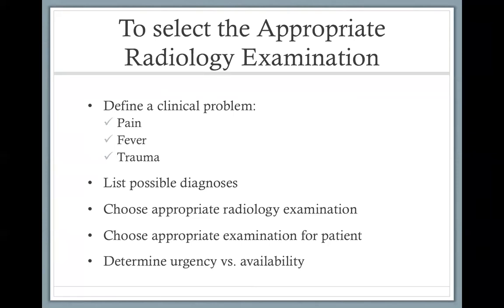For example, when we thought about the first patient, the CT brain with the subarachnoid hemorrhage, we said, well, this patient has an acute headache, so it must be some kind of stroke, right? In the patient who had headache for some time, well, it cannot be something acute. It has to be something that has been there for a few weeks.